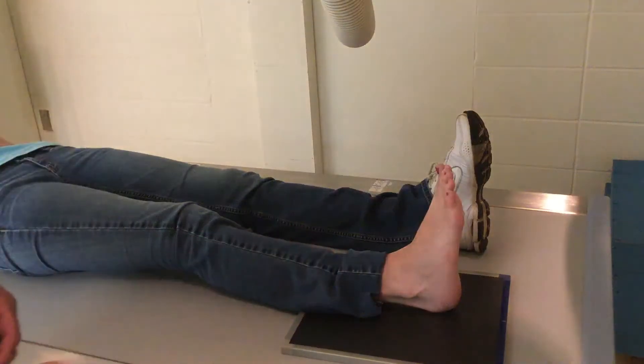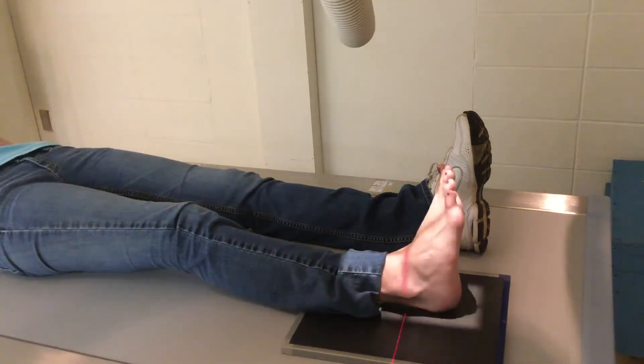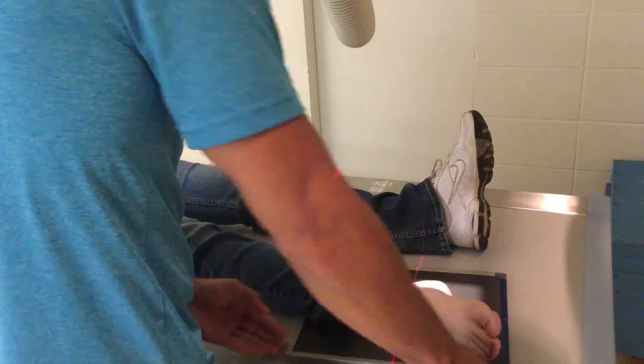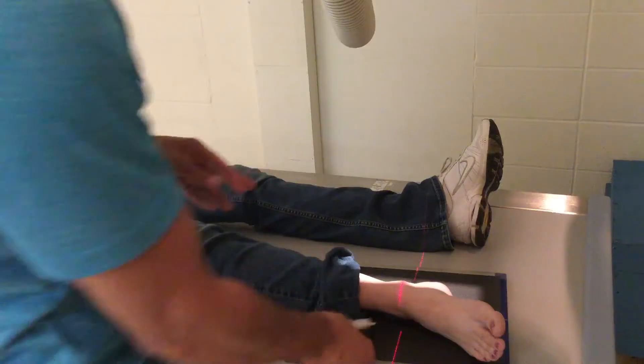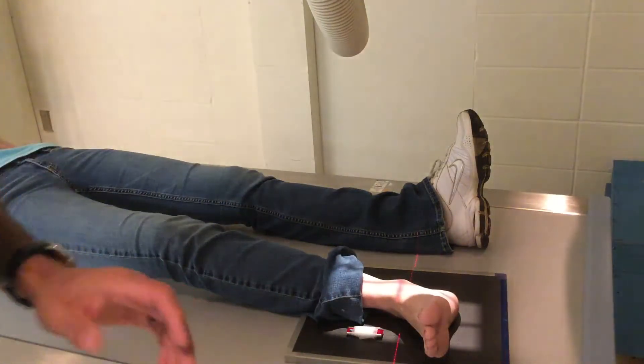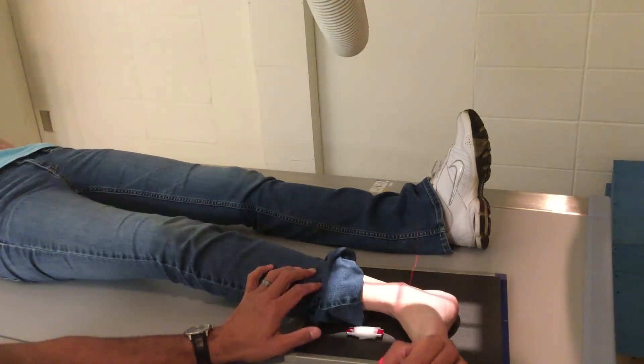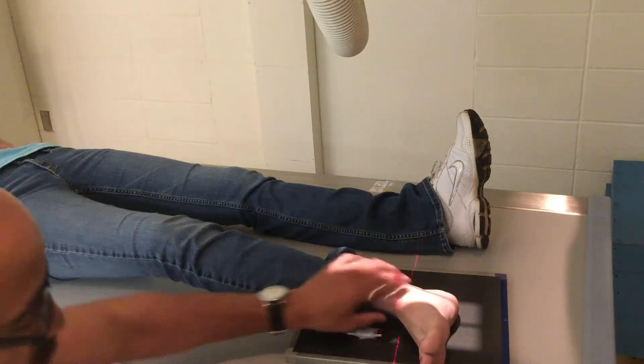For the lateral ankle, your goal is to superimpose the medial and the lateral malleoli. It's a mediolateral projection, which means you lay the lateral side down. Have the patient put it all the way out. You have to dorsiflex the toes again — toes up. Remember this is 40 inches; basically they're all 40 inches unless told otherwise. If the foot's all the way on its side, you're over-rotated and the malleoli are not superimposed.